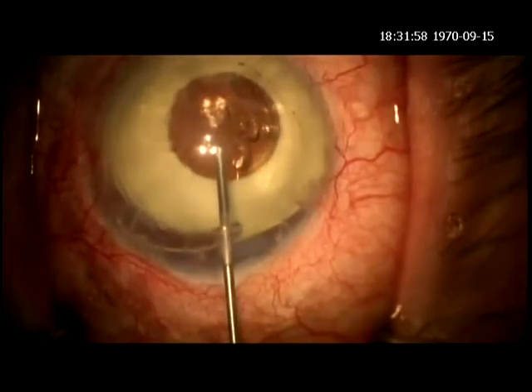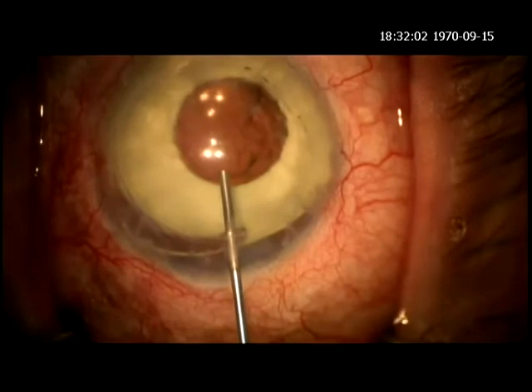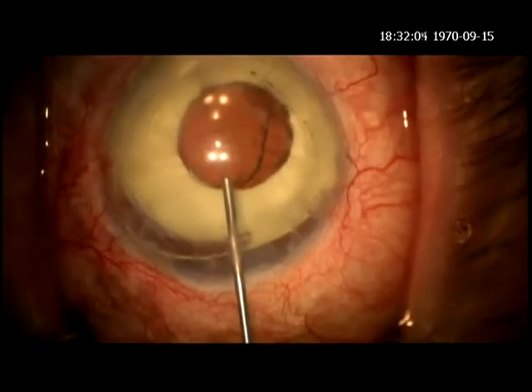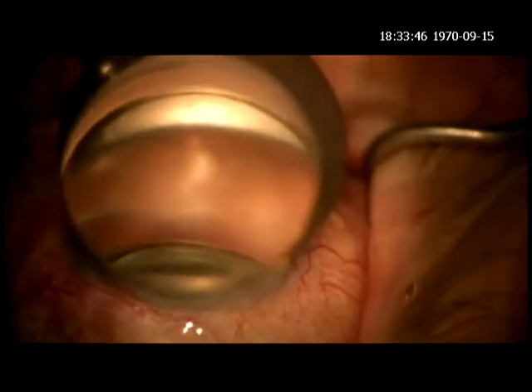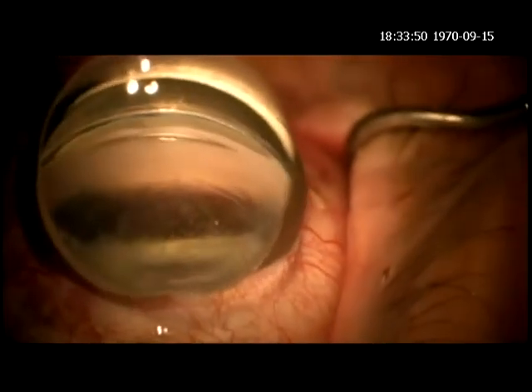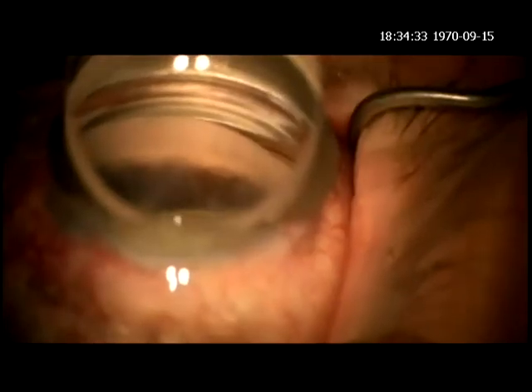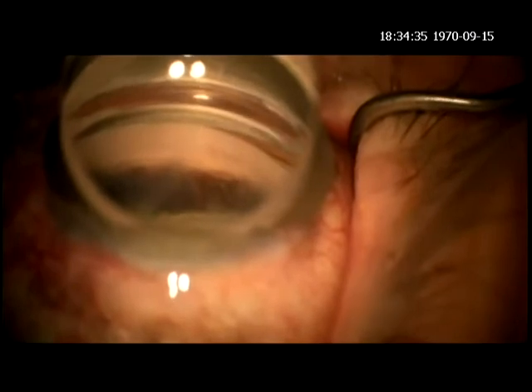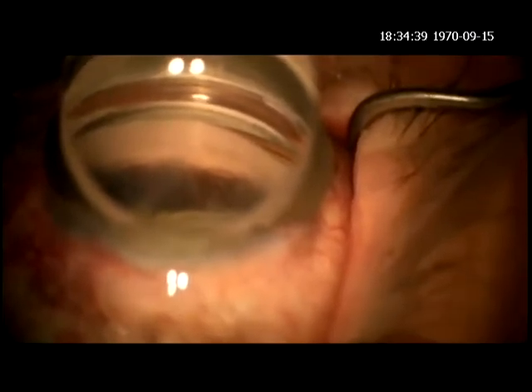As you can see, this is a one-chamber eye as a whole tube of Viscoat disappears into nowhere. The view with the Hill gonial lens is difficult because the corneal transplant is cloudy right at the edge of the host donor, right where we're looking. But as you can see just to the right of center, there's a clearer area and less anterior synechia.